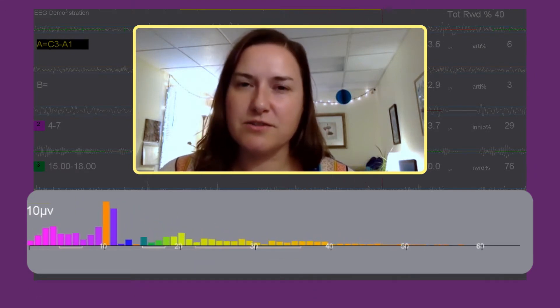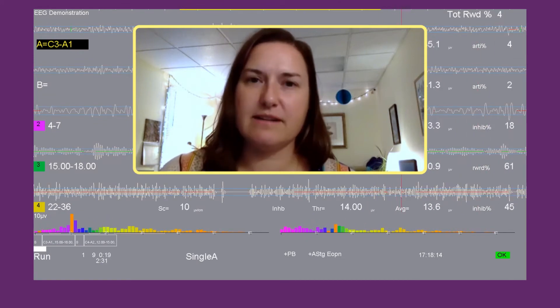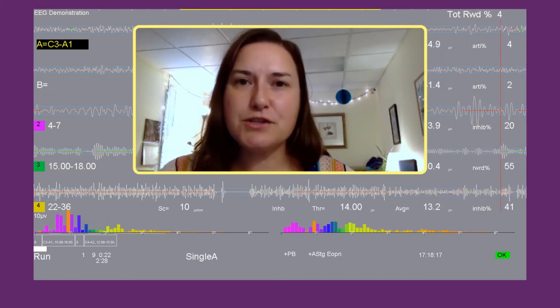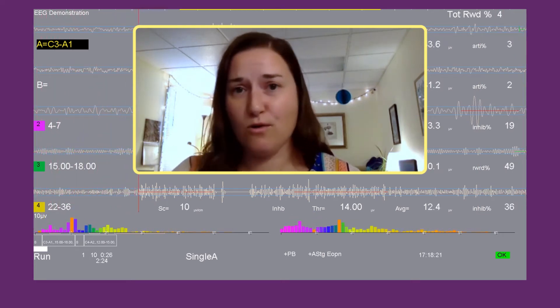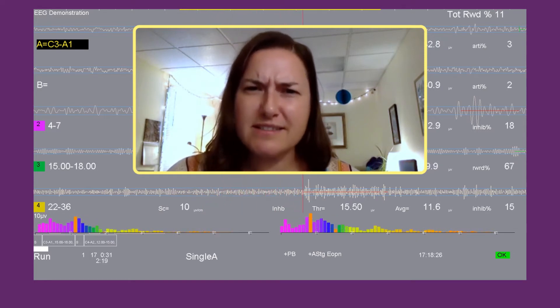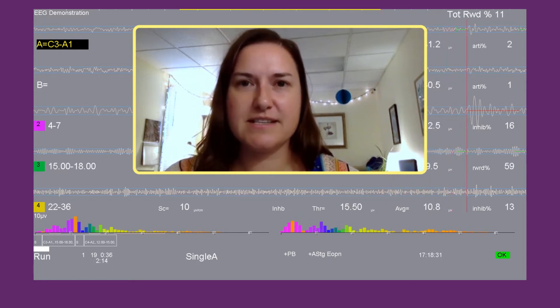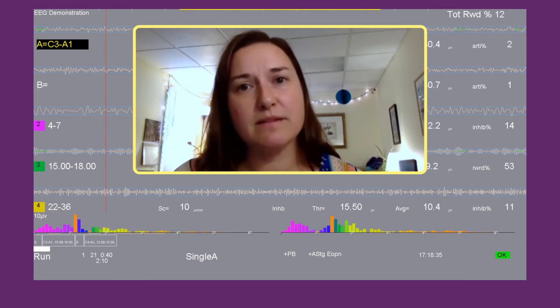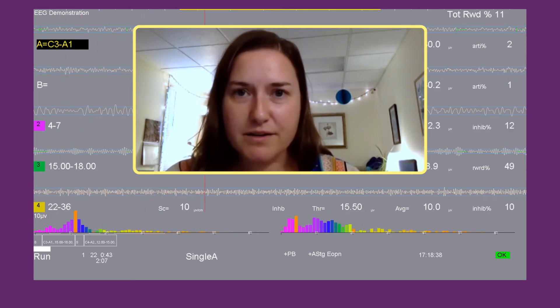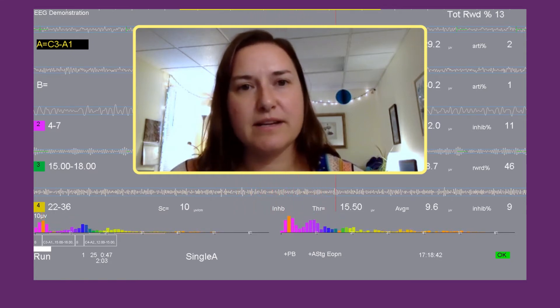So if you're watching the spectral or checking in on it — I will often look down to it during a training — you'll notice that there are two flickering orange bars that dance around the whole thing; one is really big and one is really small. That's a question we get a lot here at Eager: what is this orange flickering thing? The largest orange bar that appears is the strongest or loudest frequency in that moment in that person's brain. The small orange bar is the weakest or the quietest frequency that that brain is making in that moment.